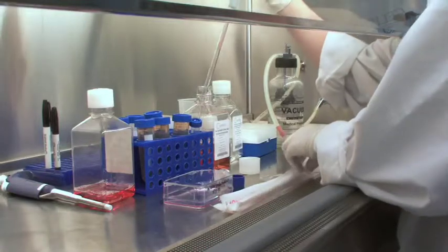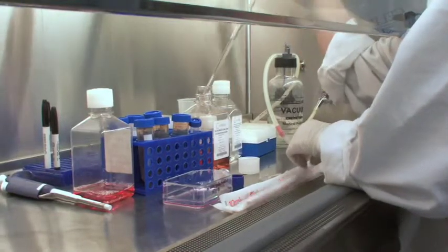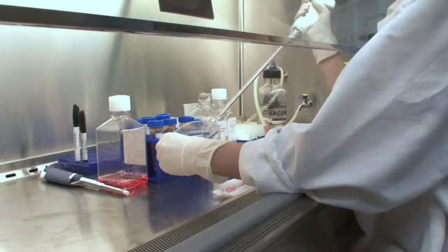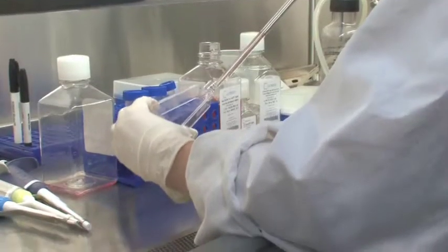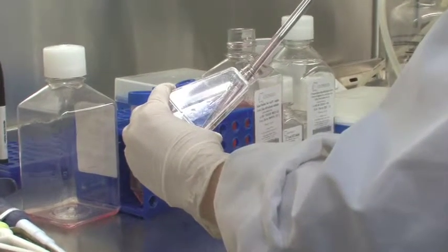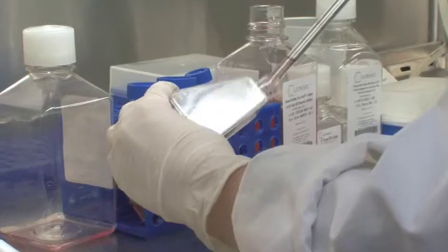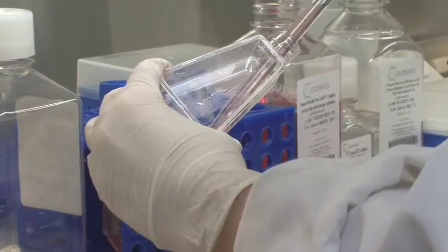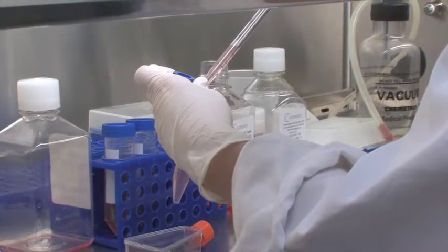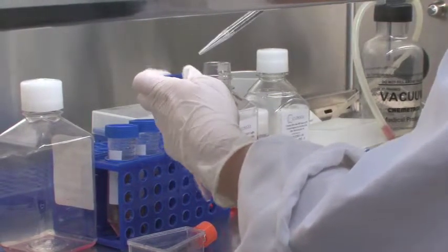Neutralize trypsin with 7 milliliters of fresh complete growth media with serum to bring total volume to approximately 10 milliliters. Note, in the T25 version, the quantities are 2 milliliters of trypsin to which you add 8 milliliters of the complete growth media to yield 10 milliliters total volume. Transfer into one sterile 15 milliliter conical tube.